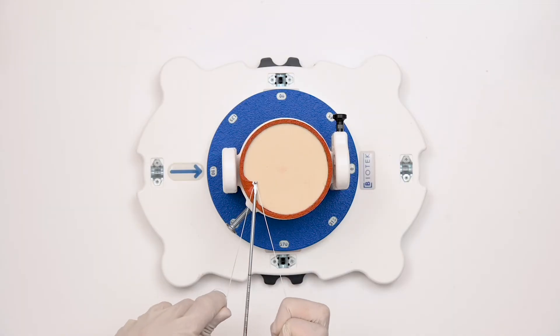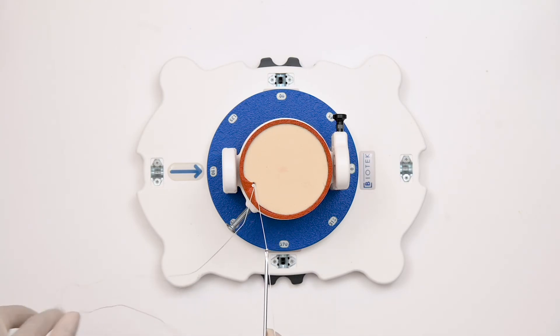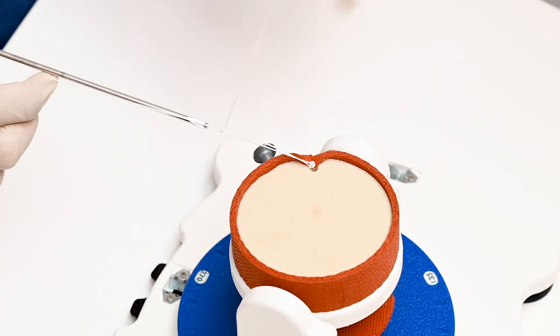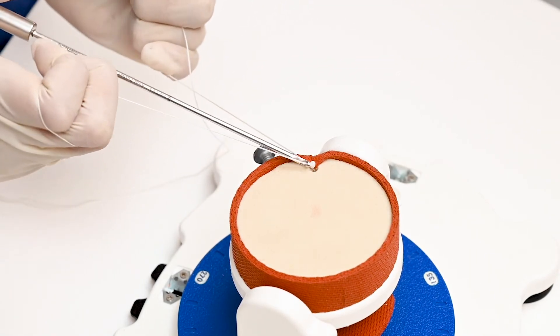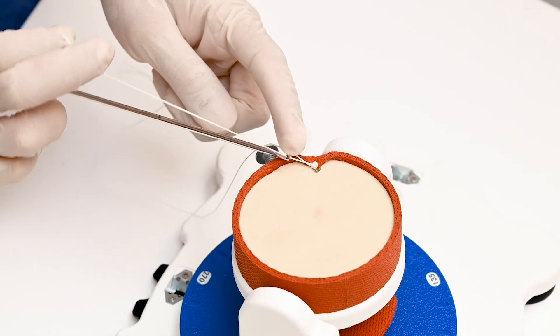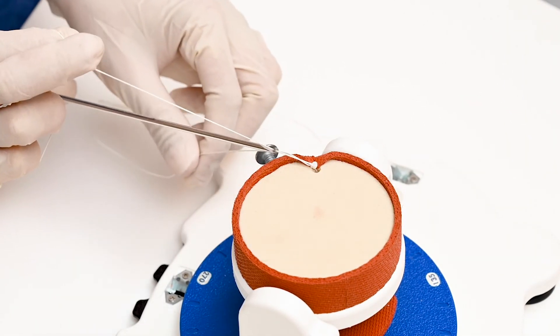This is the first sliding knot. After passing the first sliding knot, multiple half hitches are taken one by one. We have to make sure the tip of the knot pusher should not be sharp, otherwise it will cut the suture material.